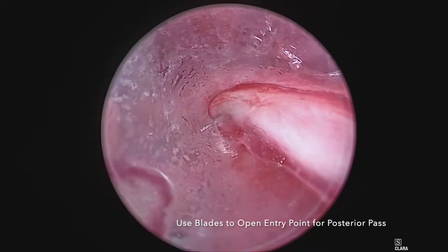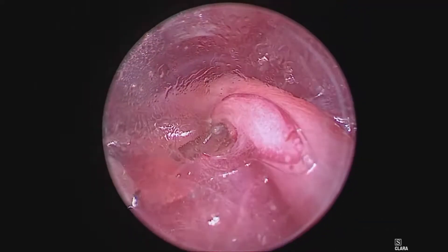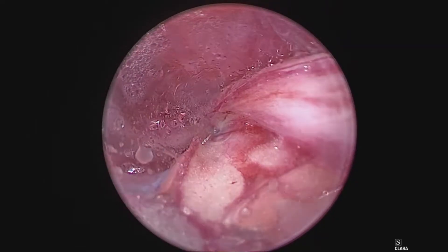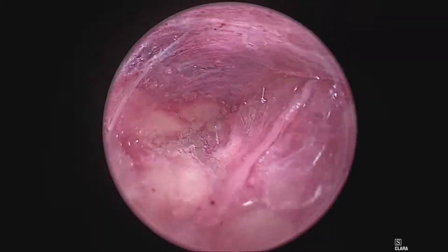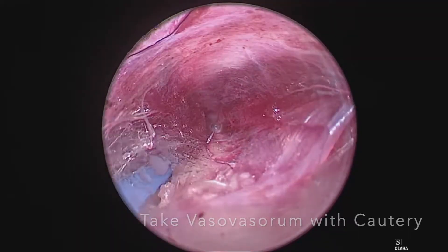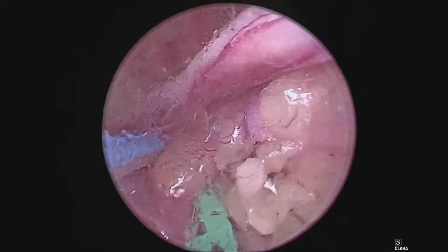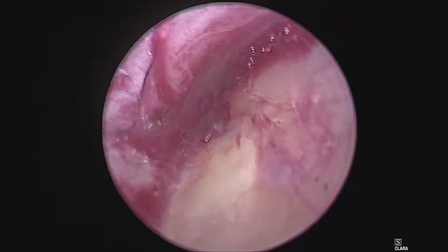Use the blades to open the entry point for your posterior pass. There usually are some small vasovasorums here that you want to cauterize to keep your tunnel dry. This extra 30 or 60 seconds will save time later because you will have a clear view your entire case. Take these small vasovasorums with your cautery and create space to begin your posterior tunnel. This will maintain a dry tunnel during your posterior pass — a technique you will use throughout the entire case.